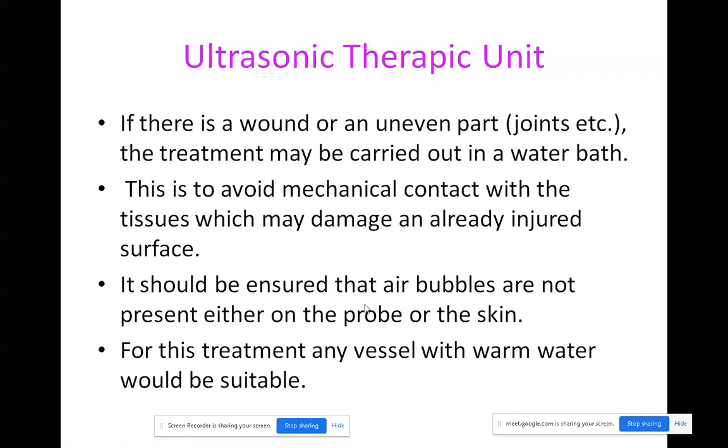So you will be taking the treatment under the water bath. This is to avoid mechanical contact with the tissue, which may damage an already injured surface. So if you use the probe on uneven parts or on a wound, it will damage that part further. To avoid that, you will be preferring the water bath. You will be doing the treatment under the water bath.